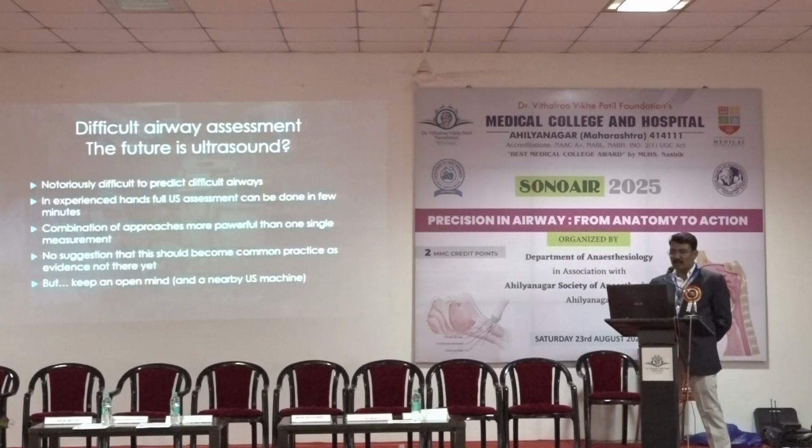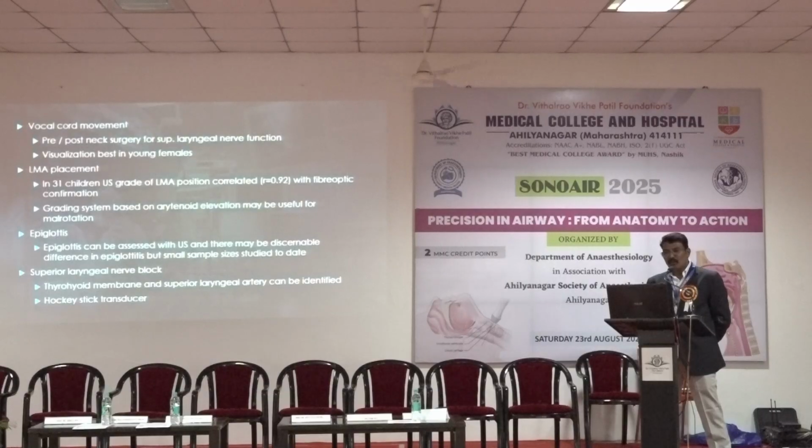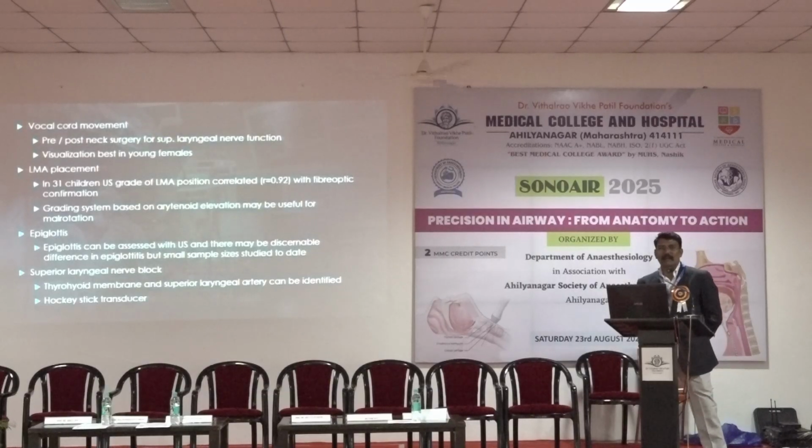The combination of the approaches is more powerful than a single one, and no suggestion that this should become common practice in every institute, or that every clinician should have expertise in this. But availability of the ultrasound machine everywhere is a very important thing.